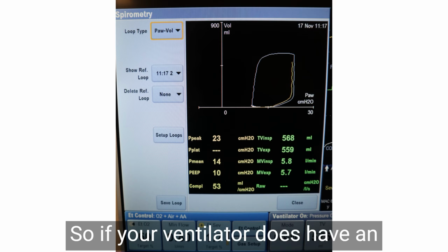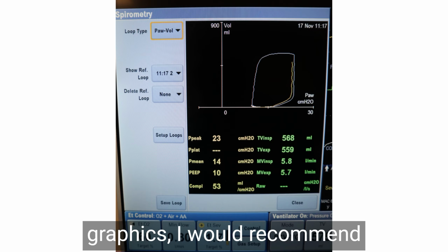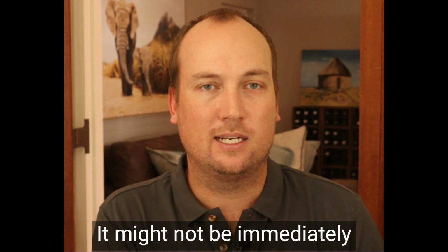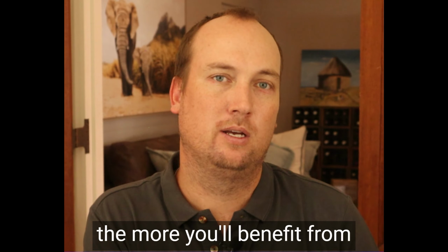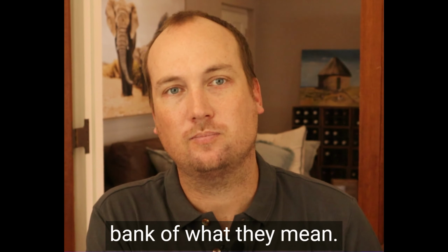So if your ventilator does have an option where you can see these graphics, I would recommend displaying it on the screen. It might not be immediately relevant to you while you're learning anesthesia, but the more you watch these graphics, the more you'll benefit from building up your own data bank of what they mean.